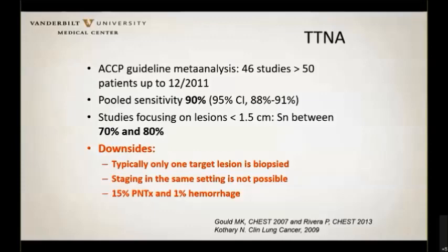As usual, the devil is in the details. If you look at smaller lung nodules, that sensitivity may go down a little bit, but it's highly variable across centers, obviously, and it's certainly old data at this point. Interestingly, we don't have great prospective data on CTNA, CT-guided biopsy in general. Certainly don't have any comparative data, which is an important point to emphasize.